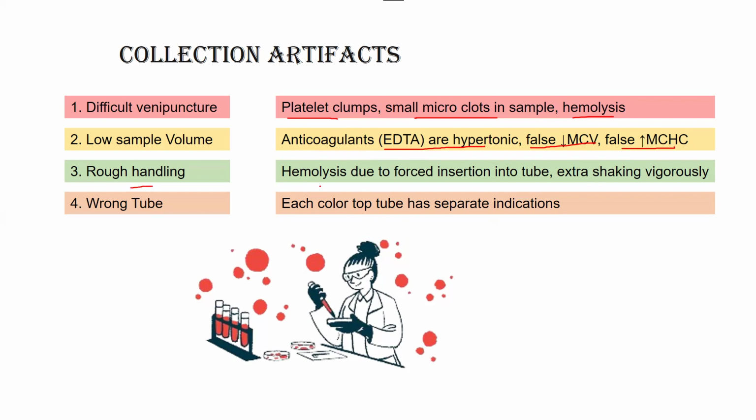If there is rough handling, it will cause hemolysis because of the forced insertion of the blood through the syringe into that tube, or because you have shaken it very vigorously. Because of that there will be hemolysis.